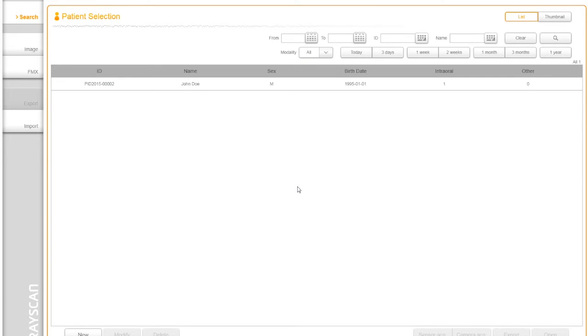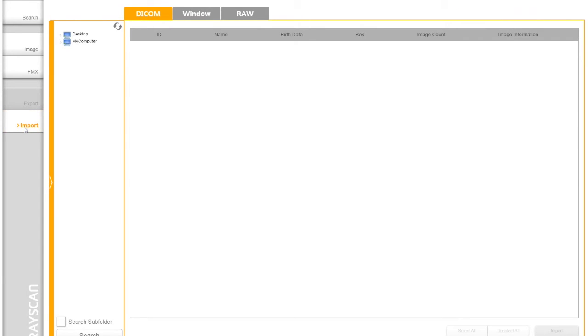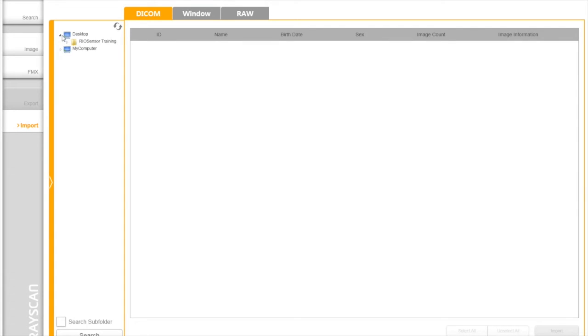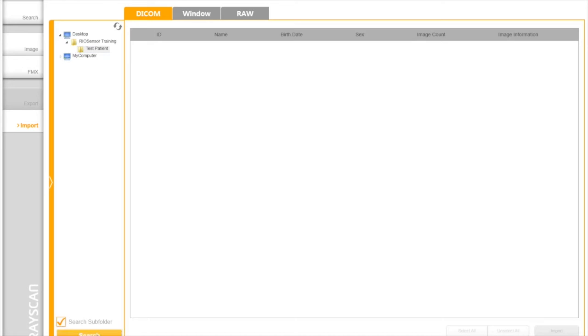There may be times when a dental practice receives images from a source outside of RioView and they wish to associate these files with an existing patient. Importing those images into RioView will allow them to be stored in the patient's DB record for future viewing. First, click the Import button and navigate to the location of the image. Click on the folder where the image exists and mark Search subfolder. Then, click Search button. If you have more than one images to import, use Select All button. To finish the import process, click on the Import button.